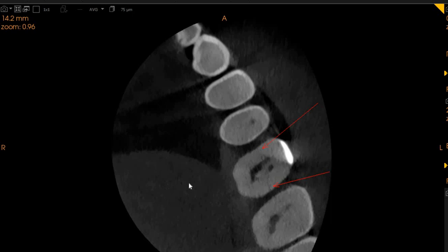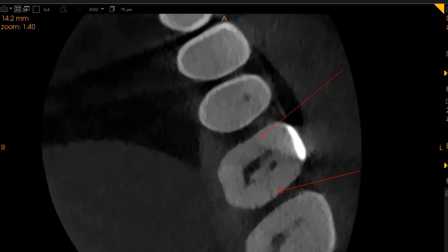We can see a very clear crack line extending from the pulp chamber mesially and from the pulp chamber distally. You can see we've highlighted this with our red arrows here, and I'm going to zoom in for the doctor as well.